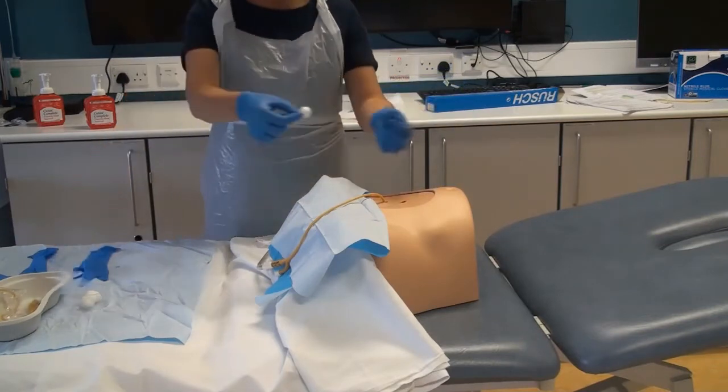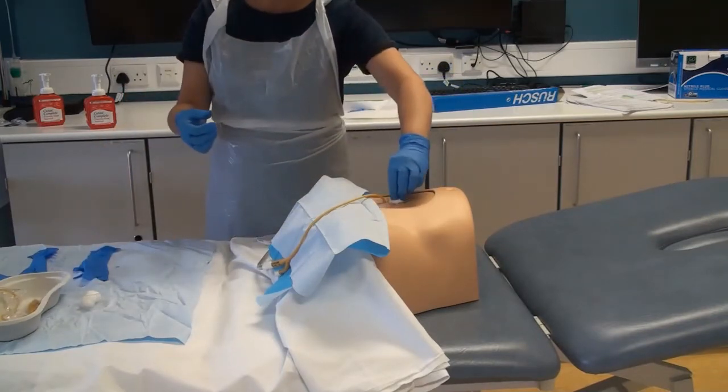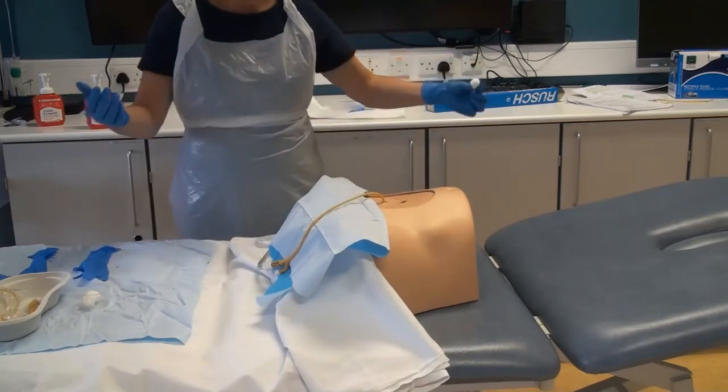Cleanse the suprapubic site using 0.9% sodium chloride.